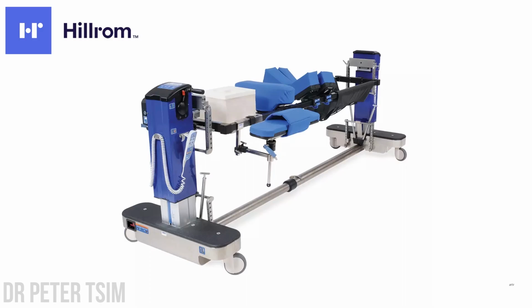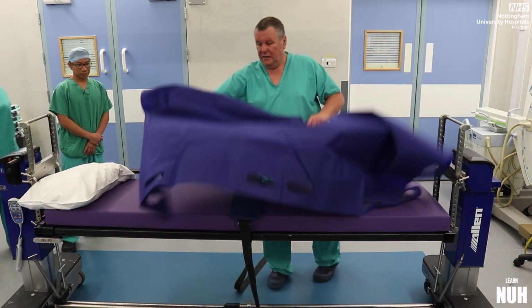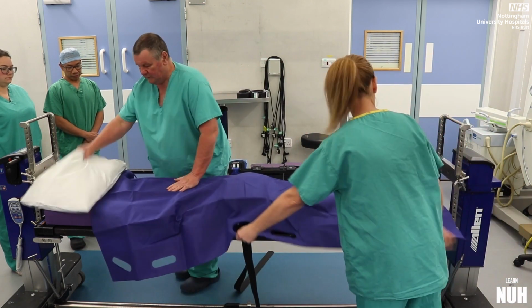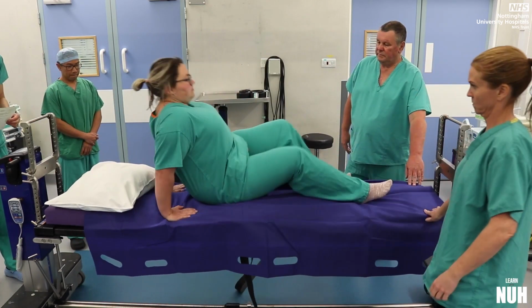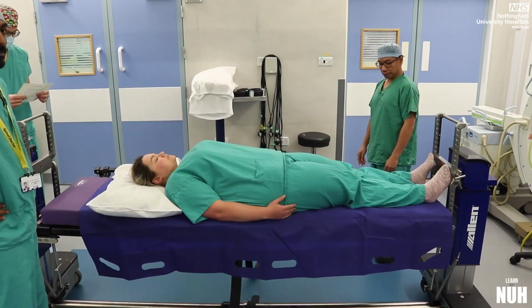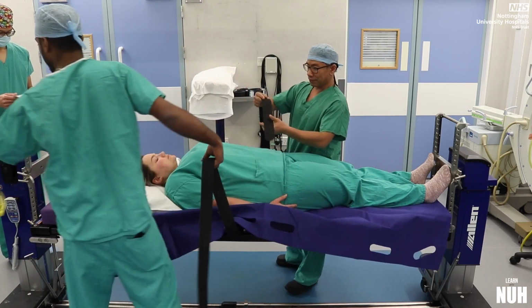This video describes how to perform a 180-degree flip using an Allen table. This procedure is helpful, particularly in patients with unstable spines. Where possible, all anaesthetic lines should be placed on the same side, as this will determine which direction to flip the patient. Attach the Mayfield clamp if you're using one. Pat slide the patient onto the Allen table's supine support. Make sure that the patient is as far down the table as possible, as this will allow easier attachment of the Mayfield clamp.